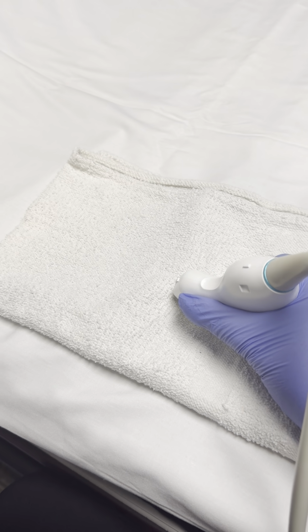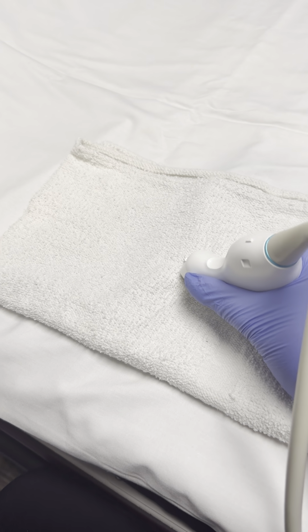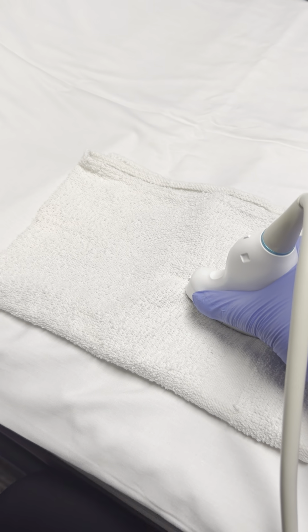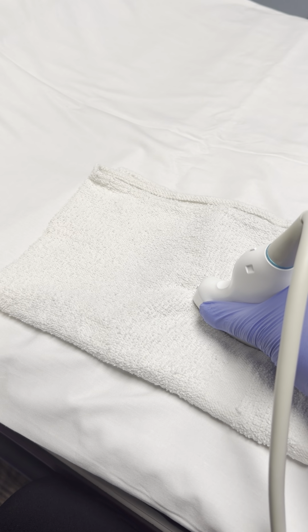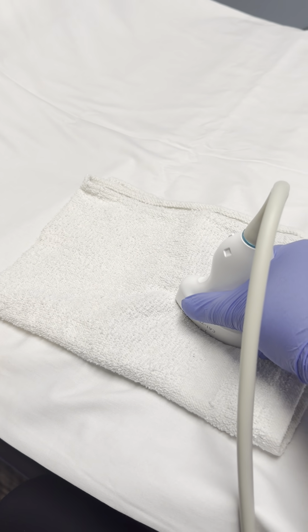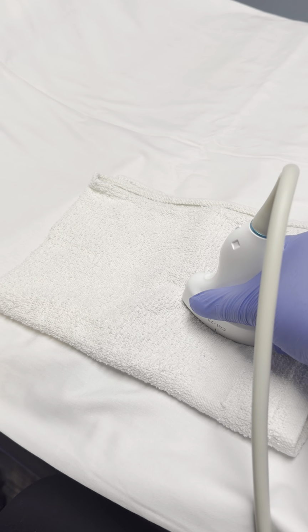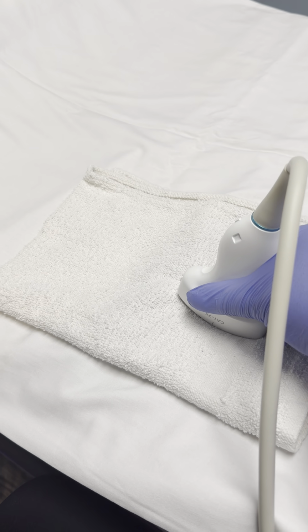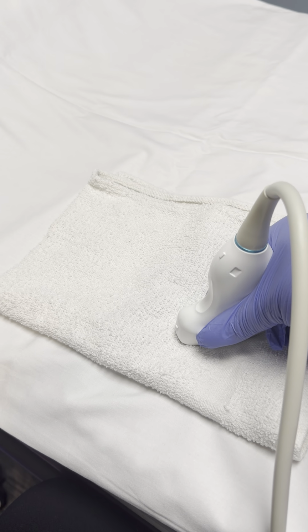Now the ductal arch, because it is superior in the heart, sometimes we have to kind of angle in just to get the ductal arch in. Now from the aortic arch level, so we're now elongated here, we want to sweep into the short axis. I'm sweeping either this way, you can see here, or if I want to do a short axis plane, you can kind of go like that to get that.